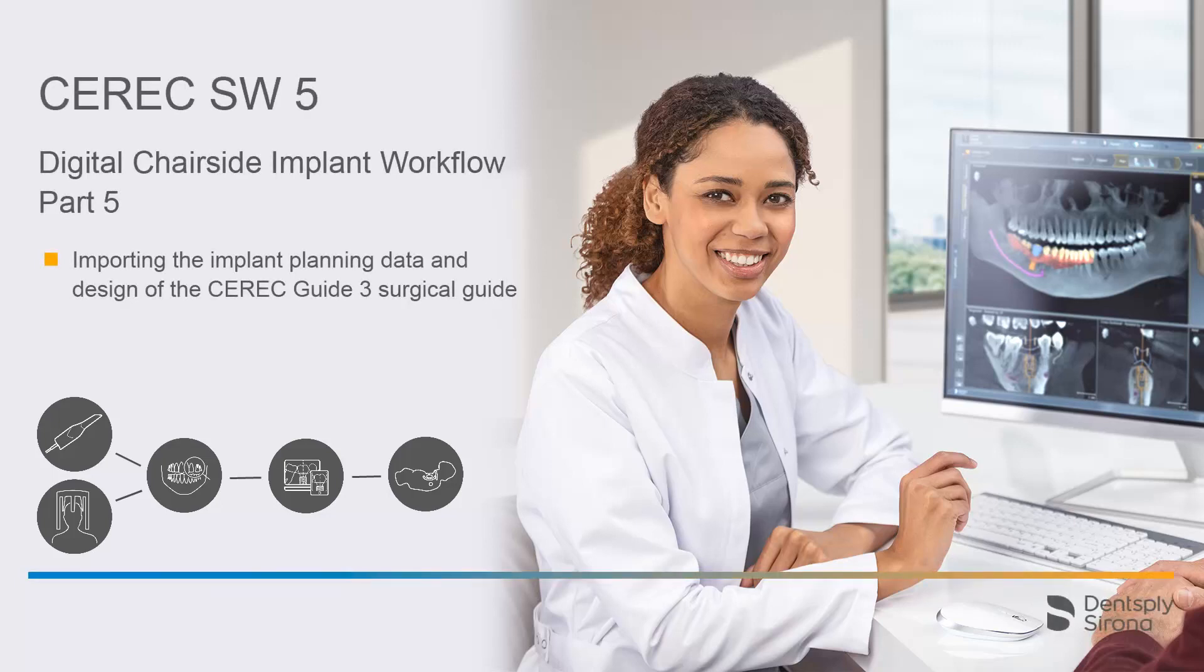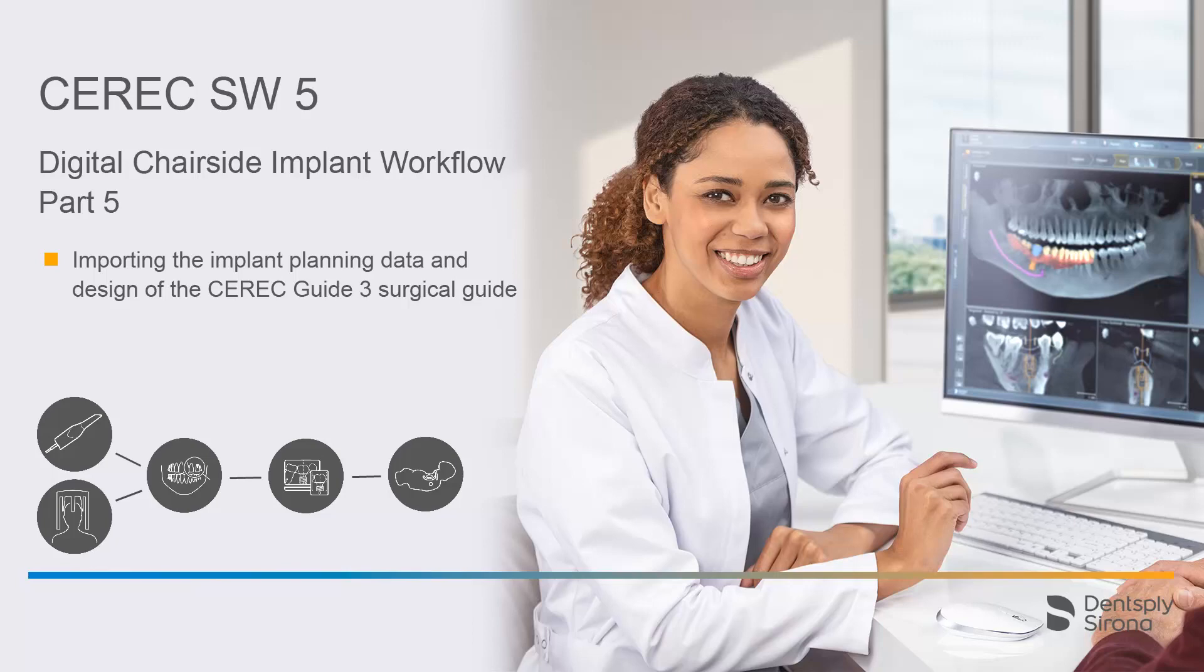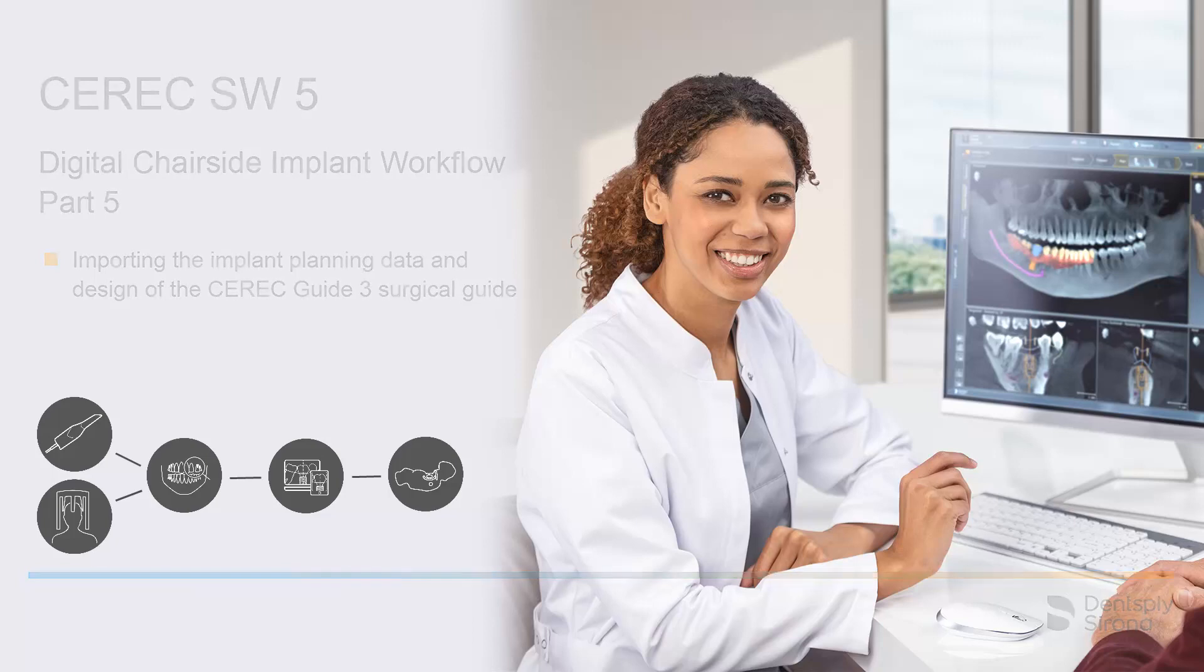Welcome to this video tutorial on the topic of Digital Chairside Implant Workflow. This video is part 5 of a tutorial series. In this video, we focus on the workflow from importing the implant planning data to designing the CEREC Guide 3 surgical guide.